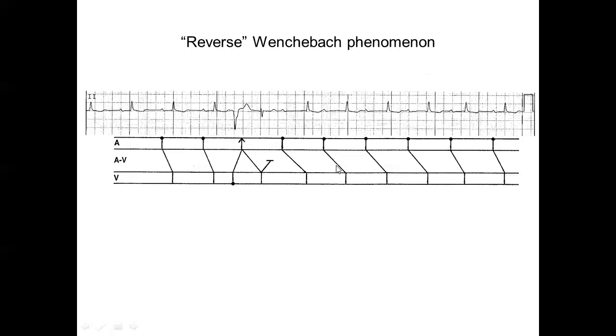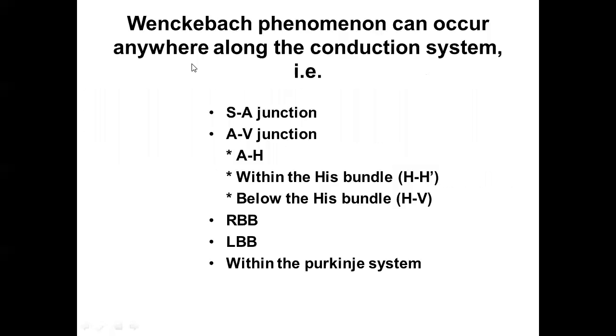The effect is lingering on, but less and less. So PR will become gradually normal, gradually shorter and shorter until it becomes normal. So you have seen everything about Wenckebach phenomenon.